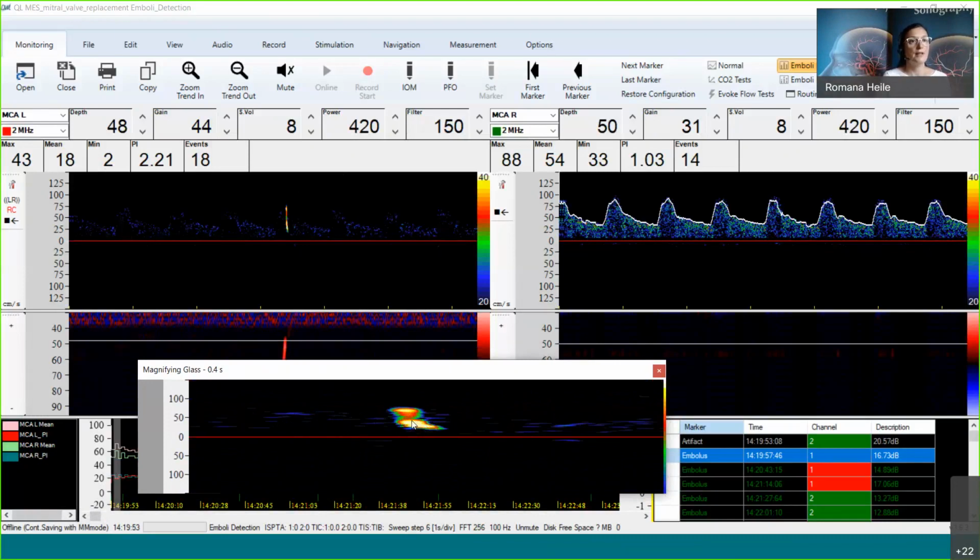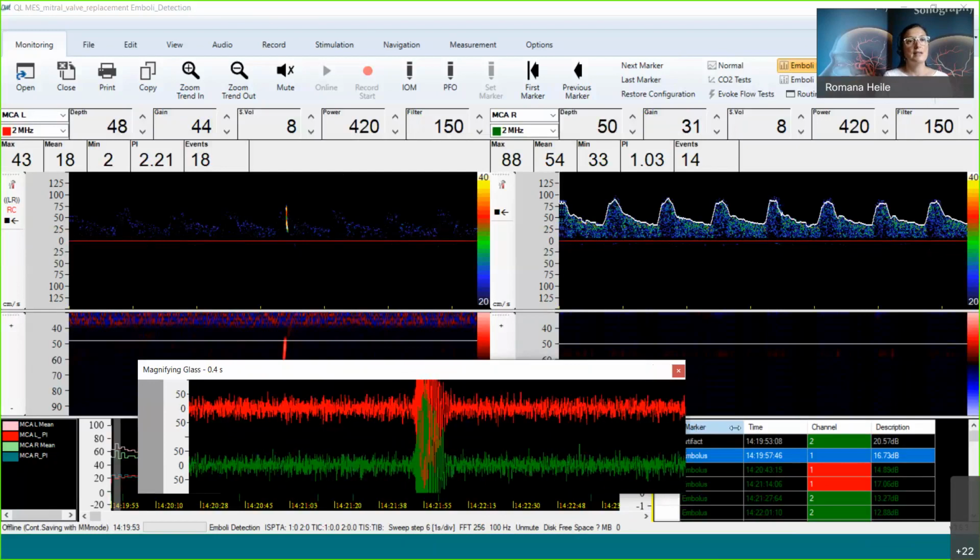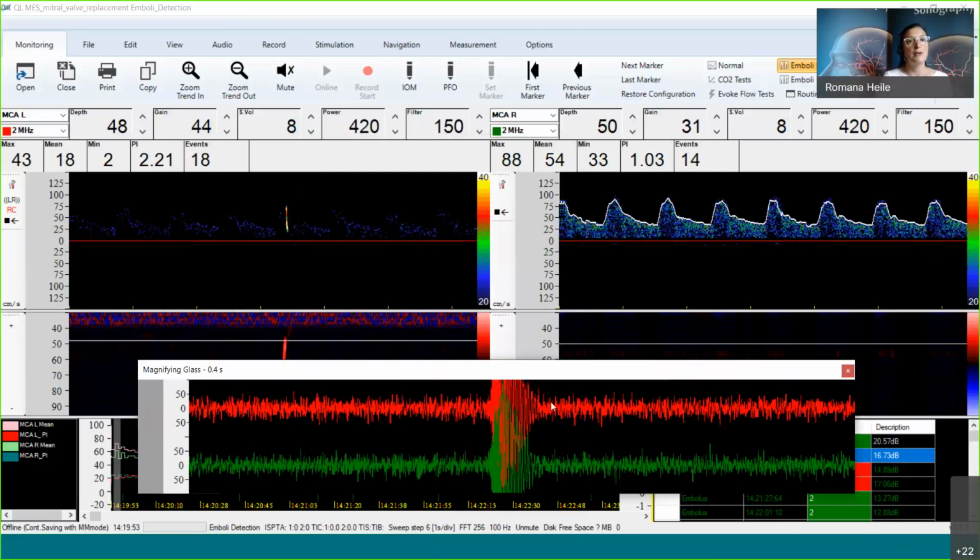Okay, perfect. Looks like a correctly identified embolus. Then we can also have a look at the raw data, which is the transient signal. This is the red, and the green means I and Q signal, and we see that first, it's having the typical spindular waveform, it's oscillating.